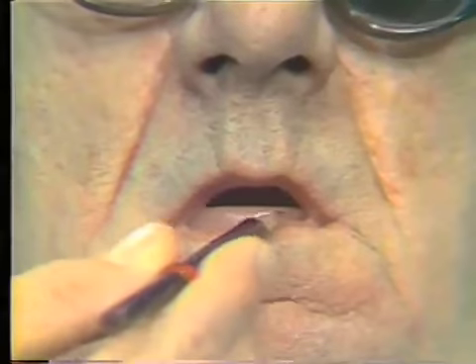I think you can see very readily that we are a bit high. We see too much of the wax rim. It is not at the corner of the mouth, but it is at least 2 millimeters above. So we will make the modification on the wax rim at the present time. We will remove this, and we will go back to the flame and cut down the height of this wax rim.